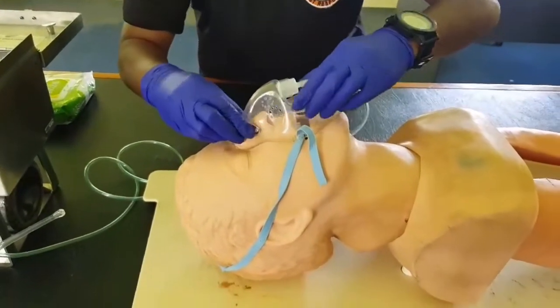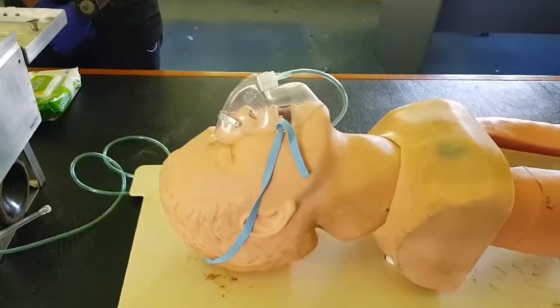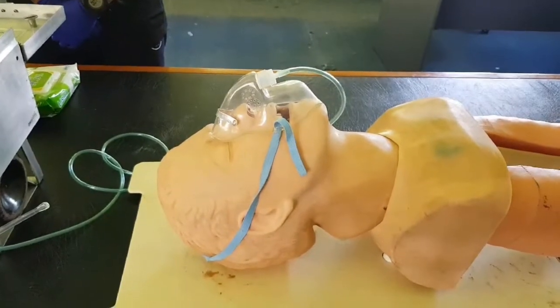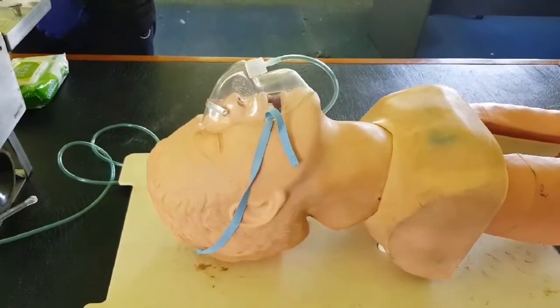When the therapy mask supplied with the Oxvivor 3 is used, a fixed flow of eight liters per minute will be delivered, giving a concentration of approximately 60% for the patient.